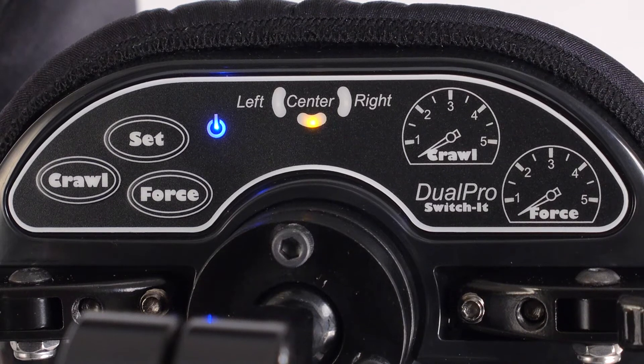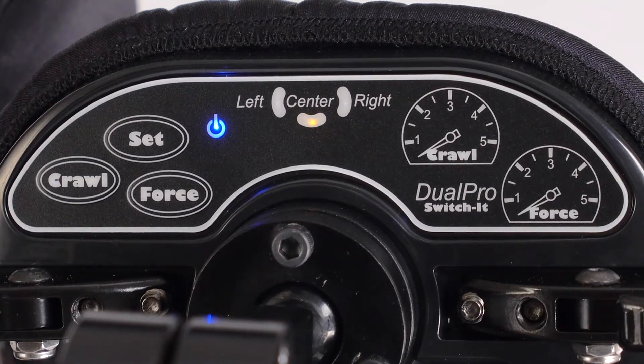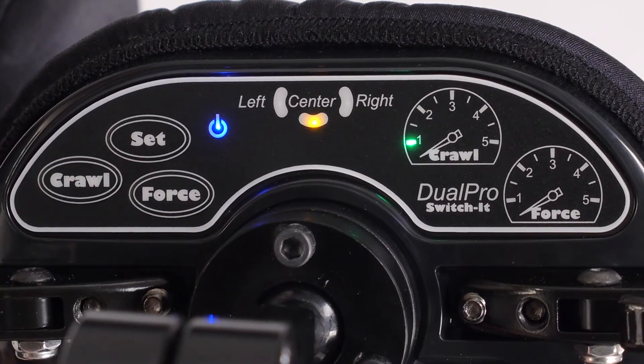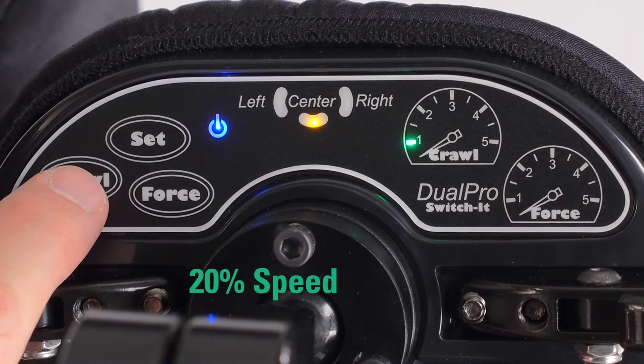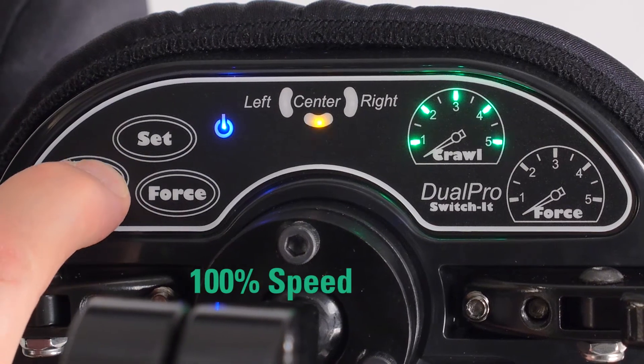If there are no lights illuminated in the Crawl indicator, the proximity sensors are disabled. Each time the Crawl button is pressed, a light is added. If one light, the chair can reach 20% of its total speed using proximity. The second light 40%, the third light 60%, the fourth 80%, and the fifth 100%.